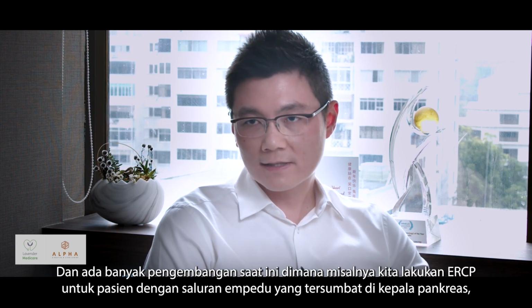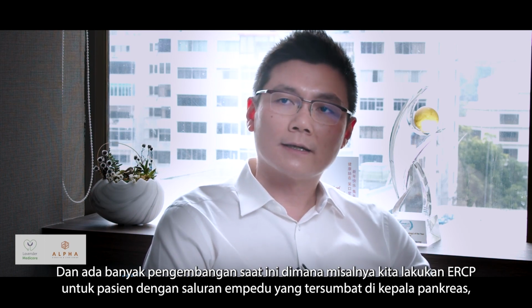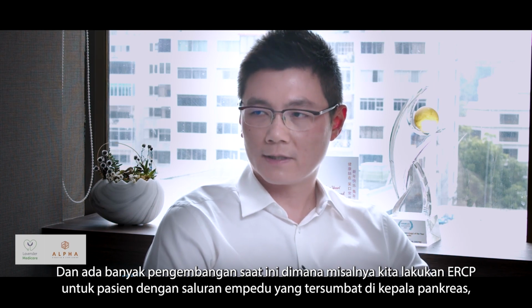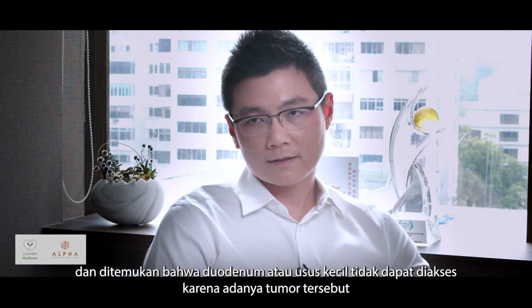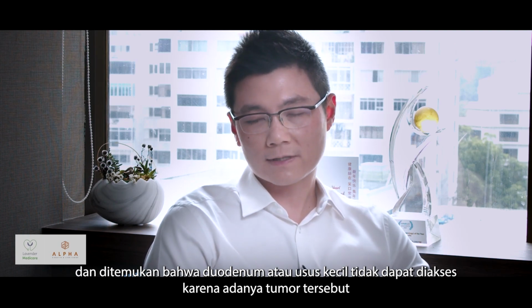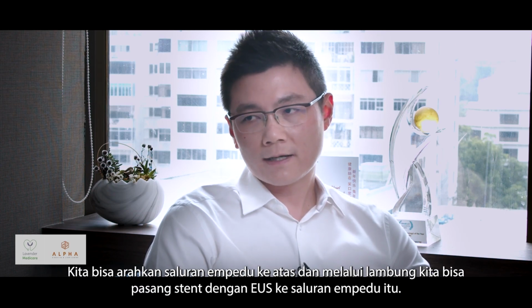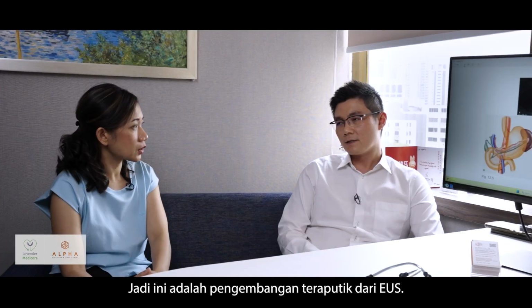And there are more advanced things now where, let's say you do an ERCP for a patient with a blocked bile duct, for example, in the head of pancreas tumors, and then you find that the duodenum or the small intestine is not accessible because of the tumor, you can actually target a bile duct higher up, let's say into the stomach, from the EUS, and you can put a stent into the bile duct itself. So this is the therapeutic advances in EUS.